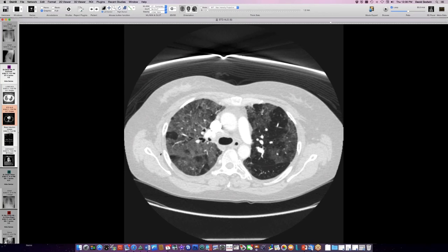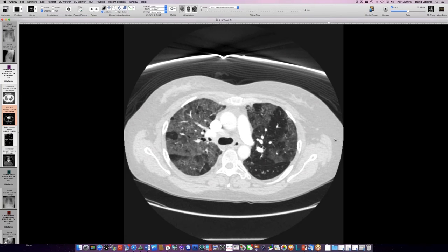Okay, have you guys seen fat embolism? Evidently the CT pattern is consistent with published cases. I haven't looked them up myself though. Yeah, not in the context of arthroplasty, hip arthroplasty, but imaging wise, that fits as you indicate.